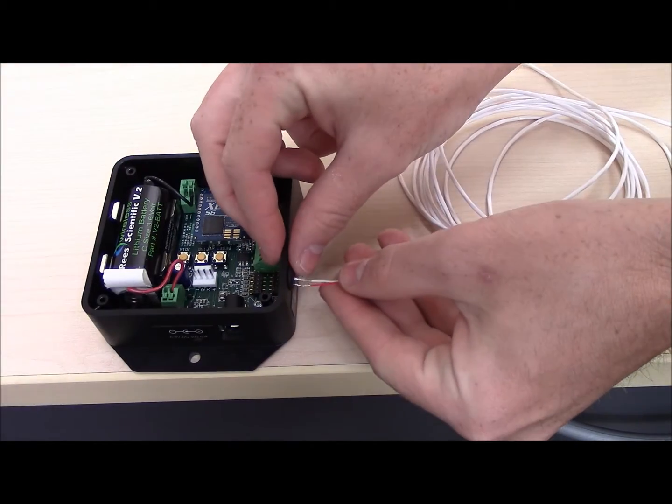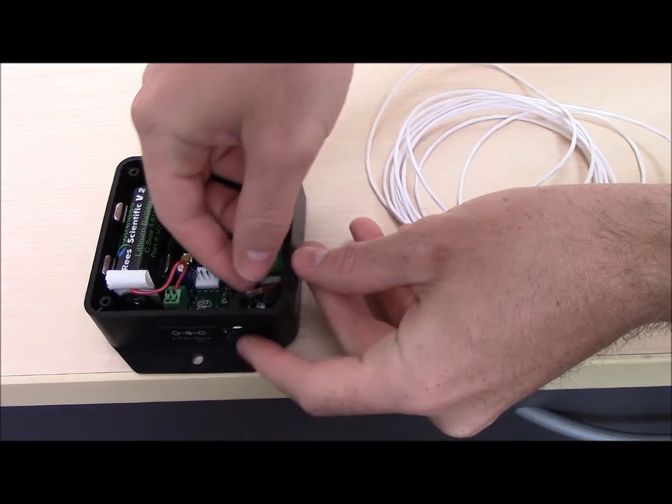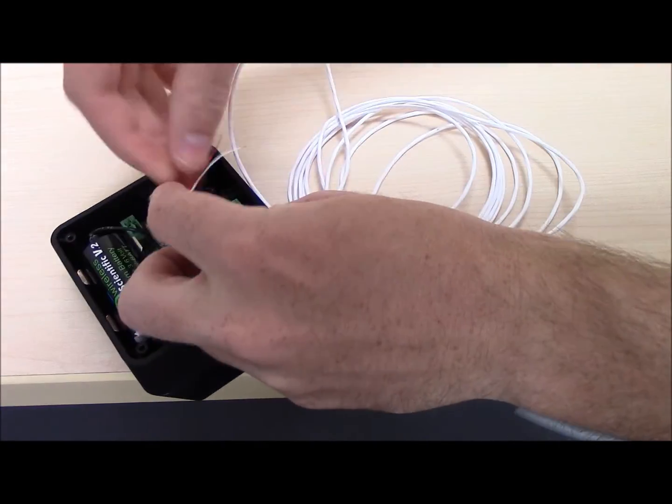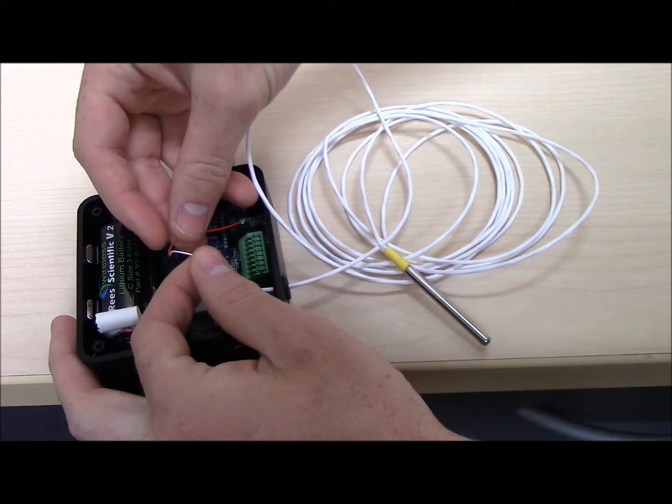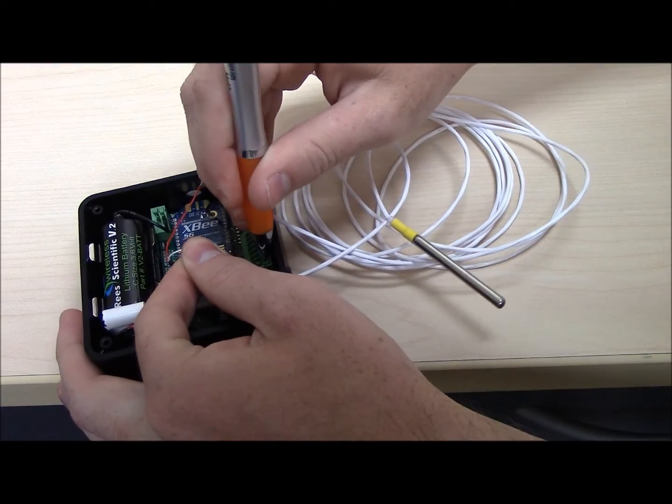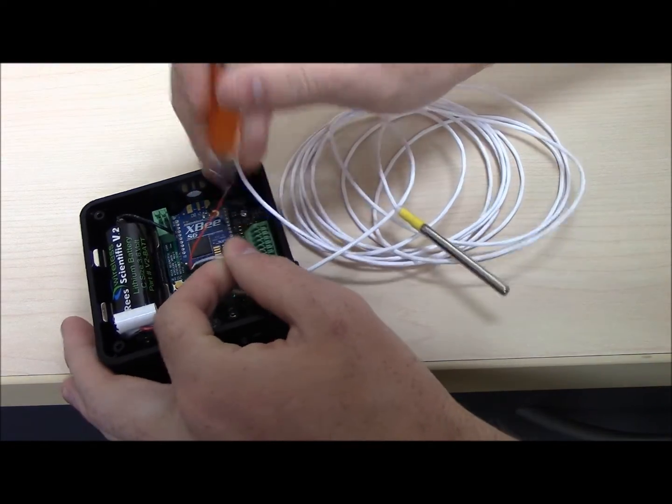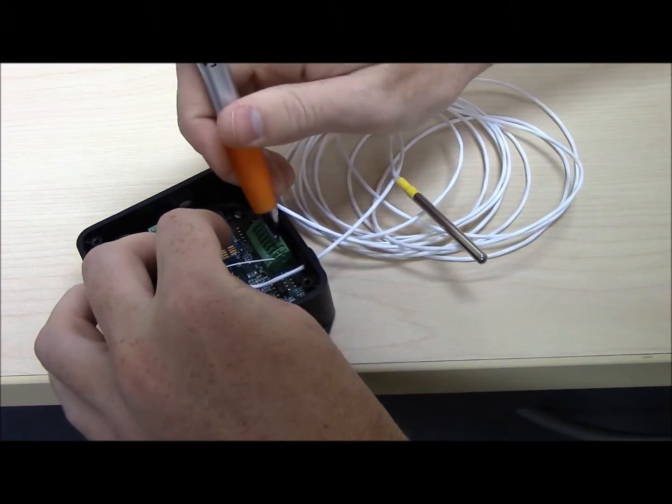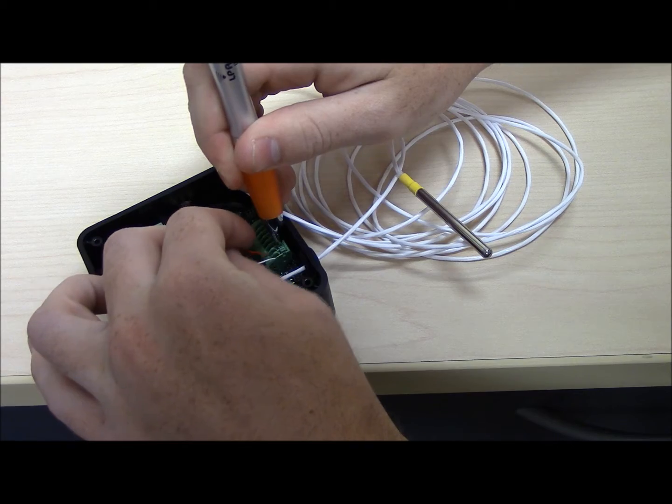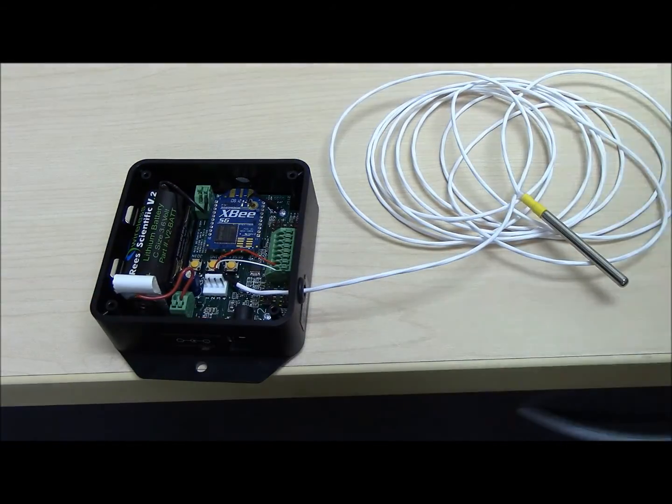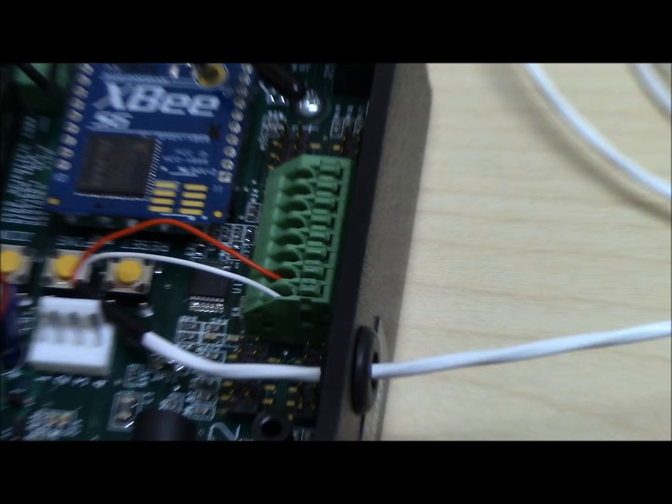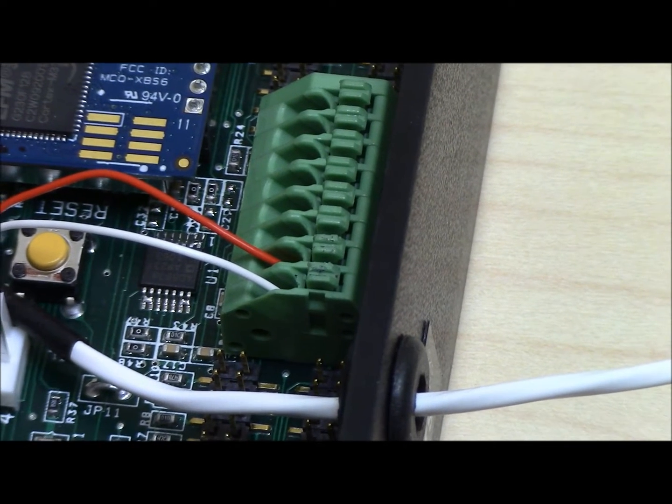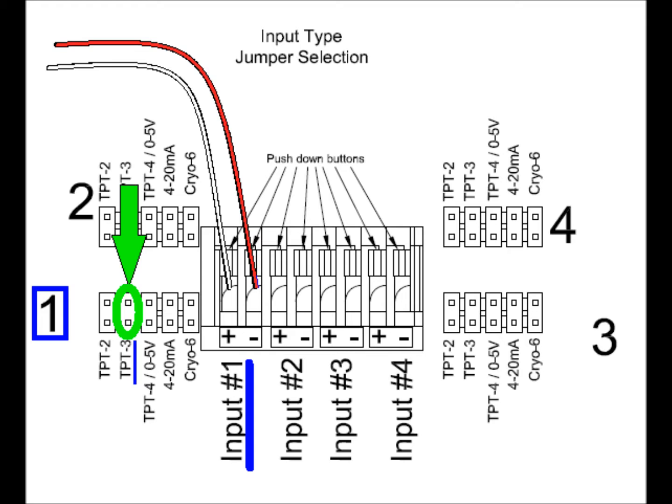Now we are going to proceed with the setup. Feed the wire end of the sensor through the designated hole and connect the red and white wires to the desired input in the green terminals. See this diagram that relates input numbers and terminal positions. This is a TPT3 sensor that will be hooked up to input 1, so the jumper will need to be placed here, shown by the green arrow.